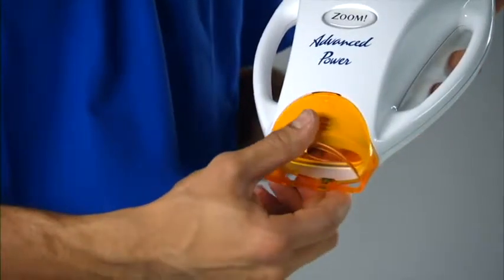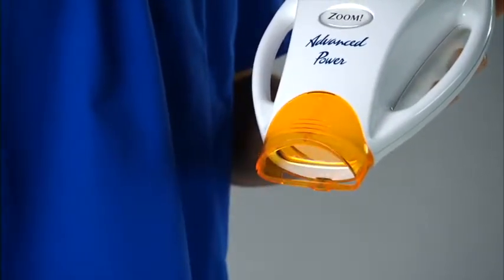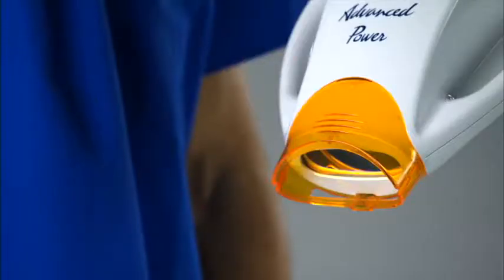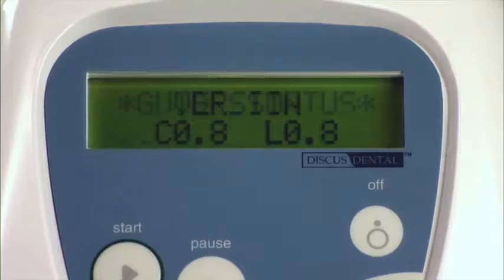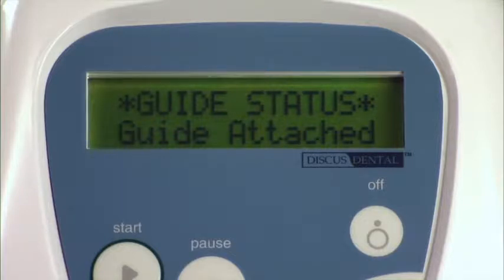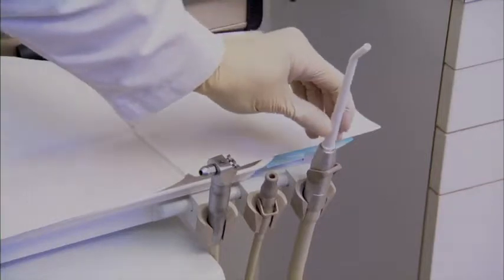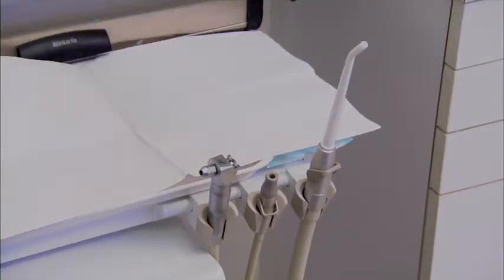Now place the light guide on the lamp. Turn the lamp on using the power button located on the side of the power pack. When the light guide is attached, the display will read Guide Status, Guide Attached, followed by 4 of 4 sessions, indicating the remaining sessions available and total sessions available. Then place the surgical suction tip provided on the high vacuum suction.